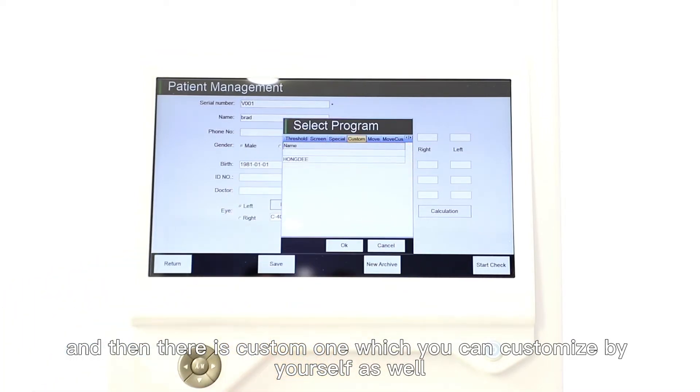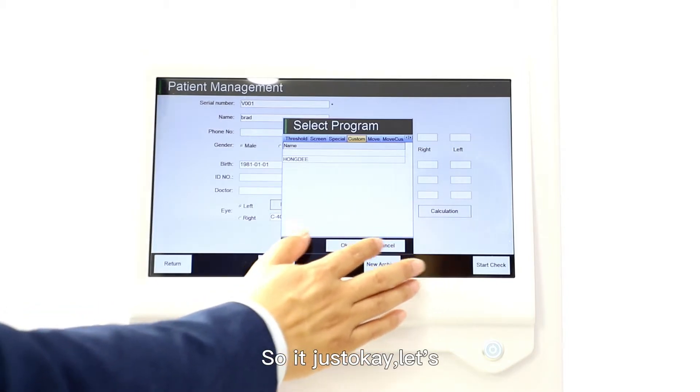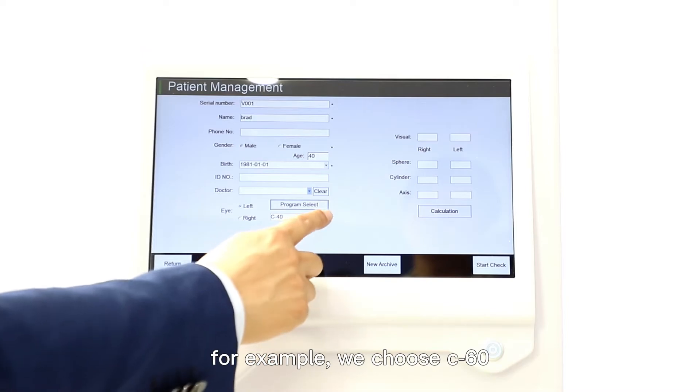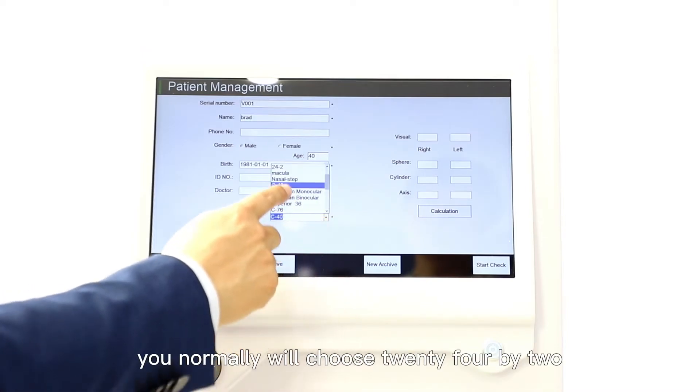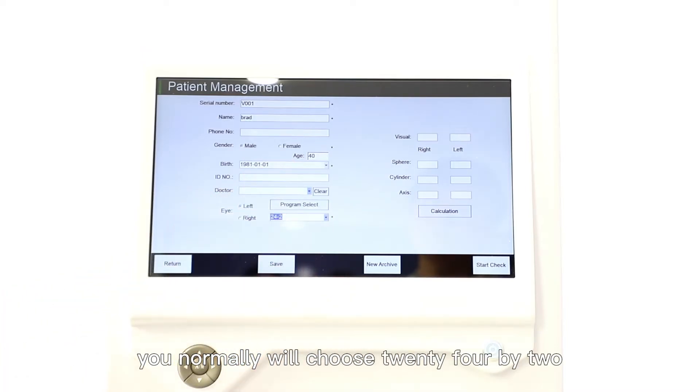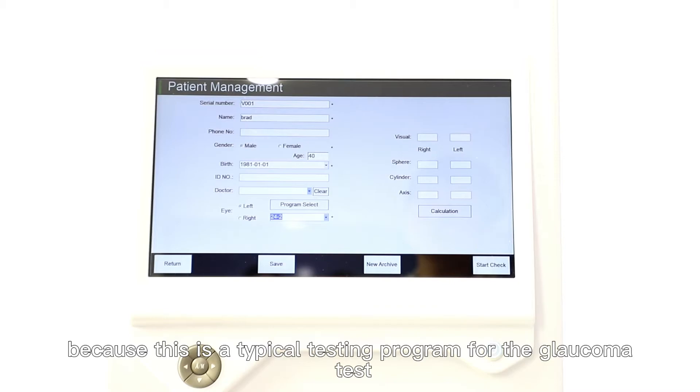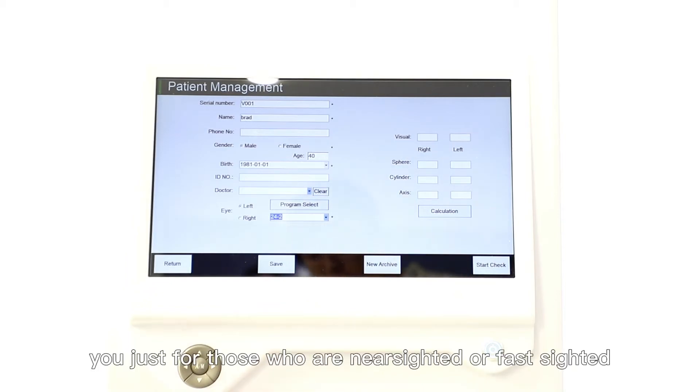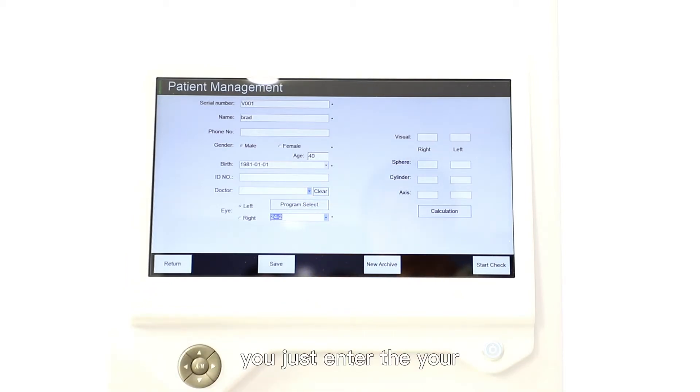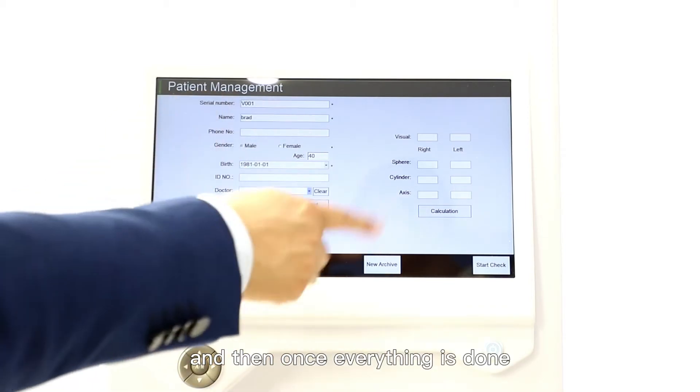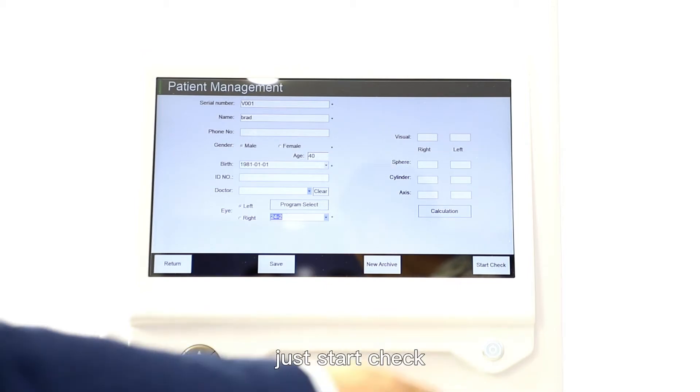There are also some special testing programs available, we have six like Esterman monocular, Esterman binocular, Esterman binocular superior 36, driver quick test, driver test, and horizontal driver test. Then there's custom one which you can customize by yourself. For example, we normally choose 24-2 because this is a typical testing program for the glaucoma test. On the right side, for those who are nearsighted or farsighted, just enter the operator's degrees, and then once everything is done just start check.